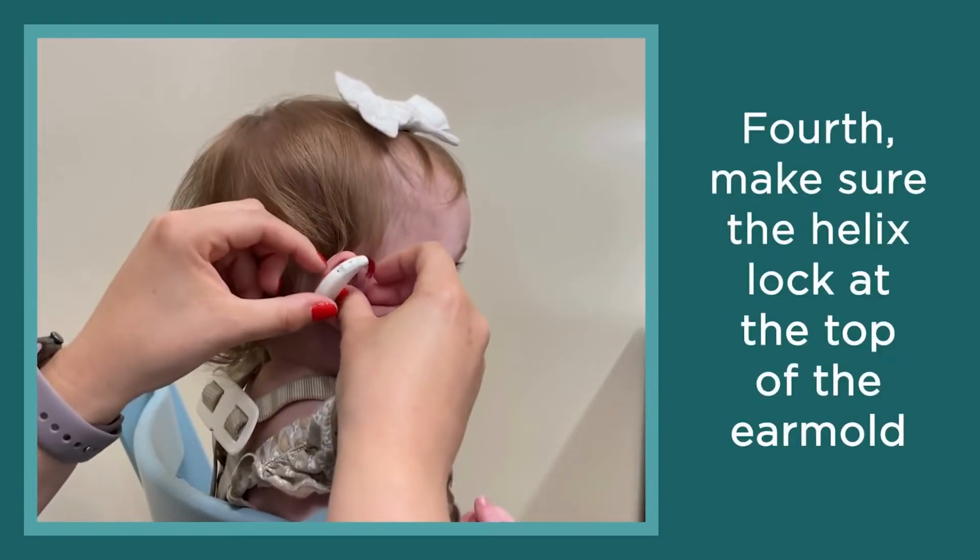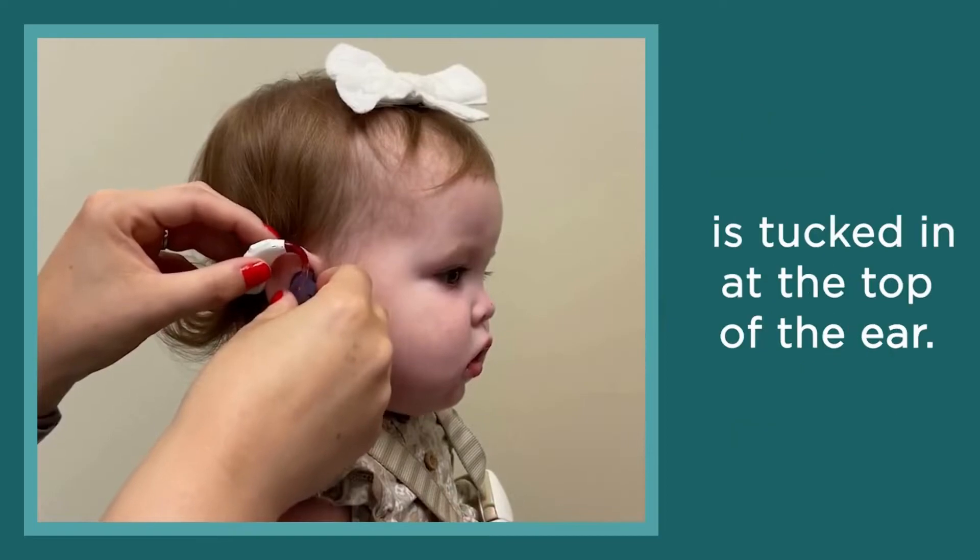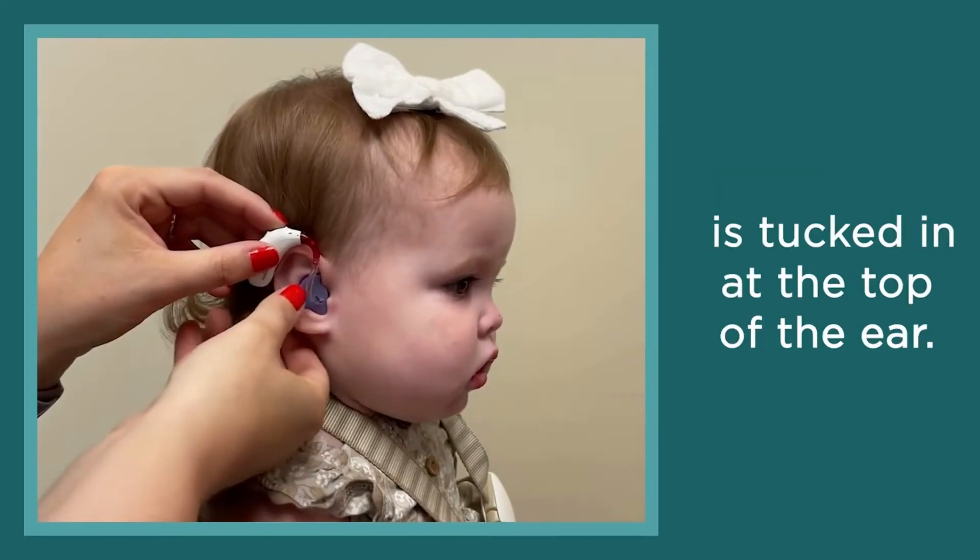Fourth, make sure the helix lock at the top of the ear mold is tucked in at the top of the ear.